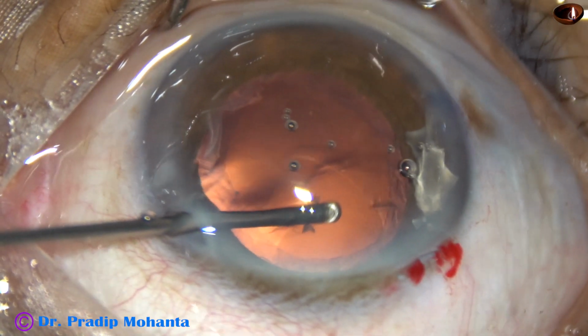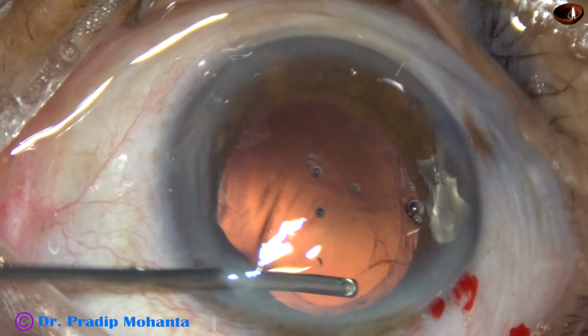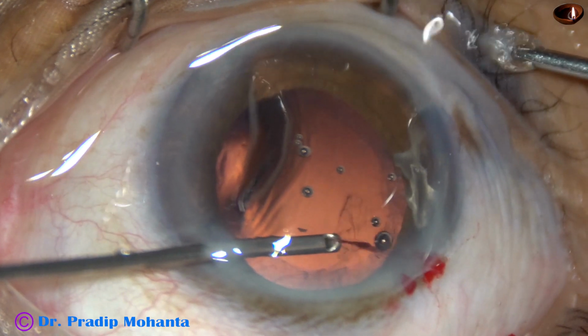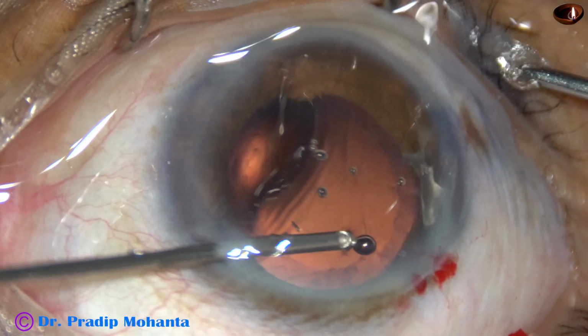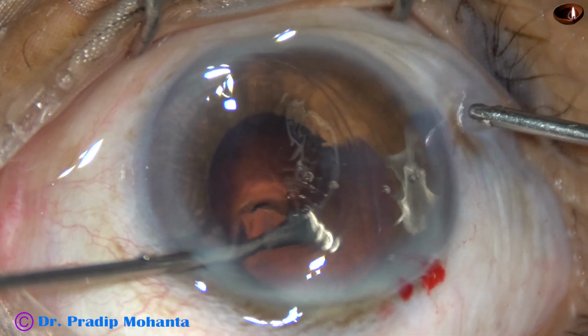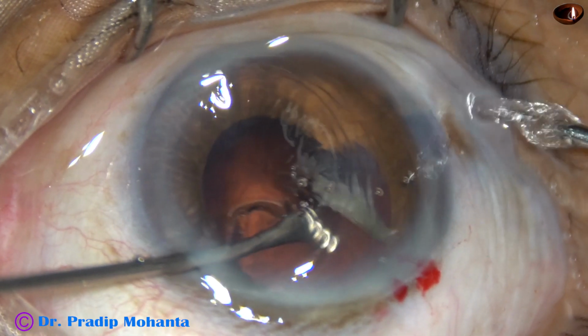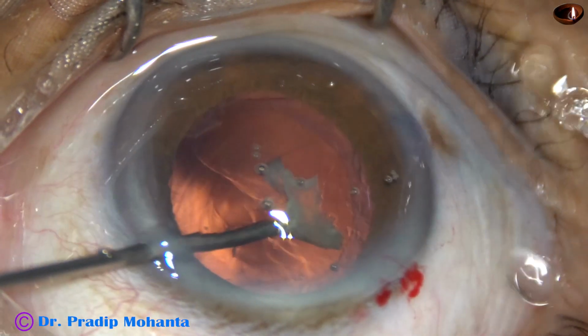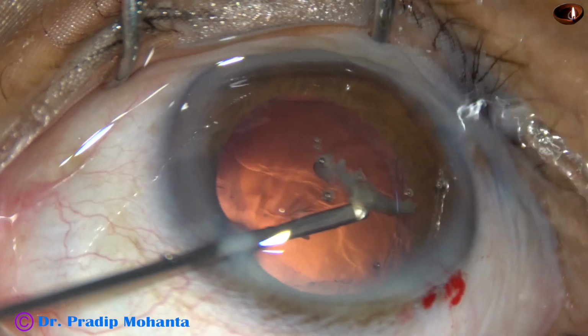Now, before introducing the irrigation, I'm using the cutter and aspiration, and we can see that the anterior chamber is tending to collapse. But I am in the anterior vitreous, and before the chamber collapses, I use some irrigation.